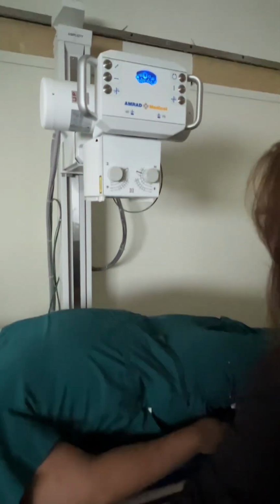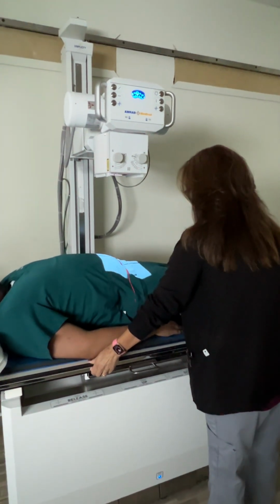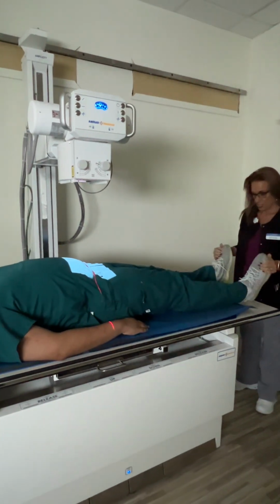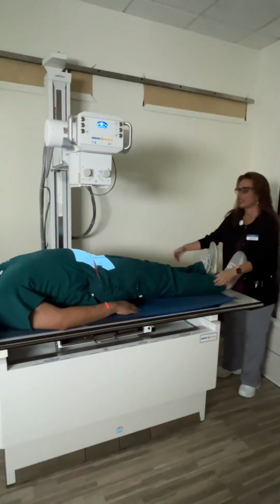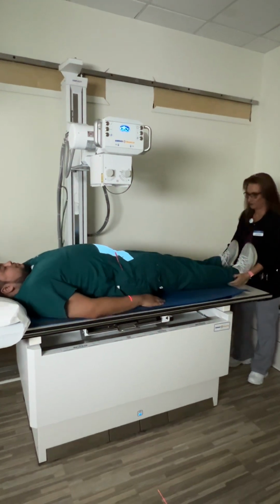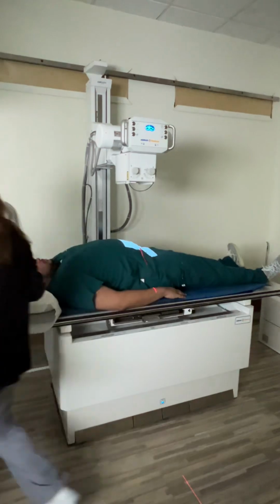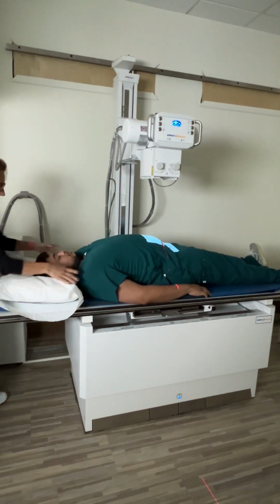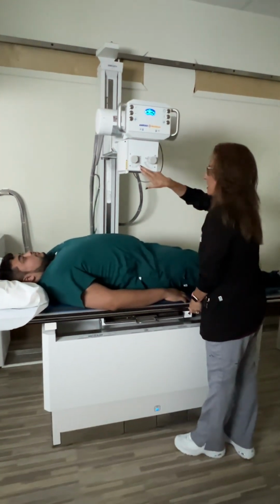If I look a little screwy on the equipment, it's basically because this is new equipment to us. So I'm just trying to get my bearings. Usually when you have a patient on the table for something, you just want to kind of make sure they're straight. Can you scoot your hips to your right just a hair? Good. And you do not have to keep your feet like that. You can relax them. Just want to make sure the patient's straight so that when he's imaged, it comes out straight.